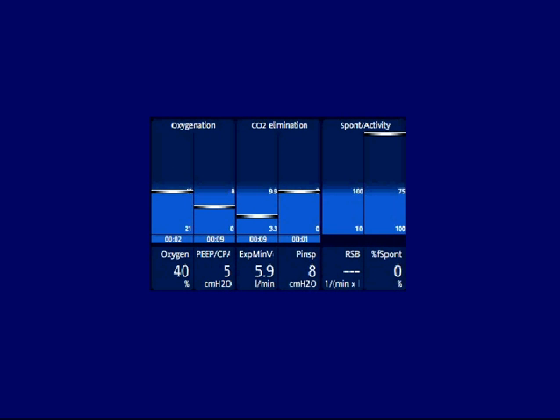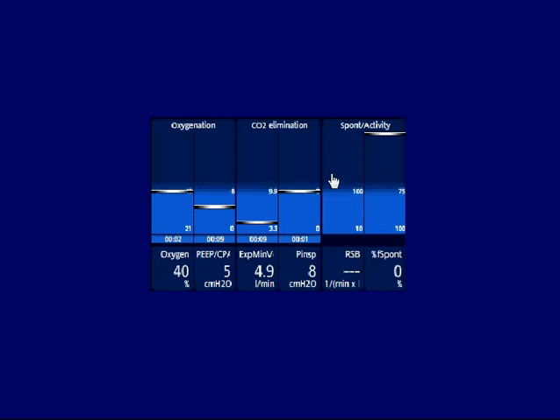This next slide shows that the patient has progressed. The oxygen has been titrated down and it doesn't take as much peak inspiratory pressure to ventilate this patient. However, they haven't initiated any spontaneous breathing at all. Since the spontaneous activity criterion hasn't been met, you'll notice that these timers are blank — they won't go off until the patient gets into the weaning zone.